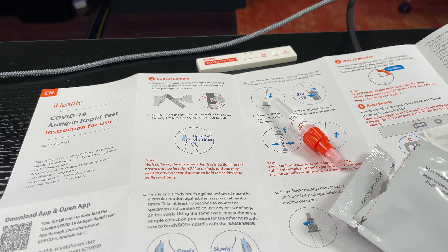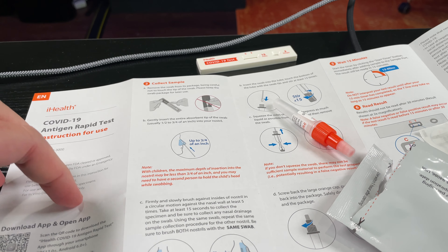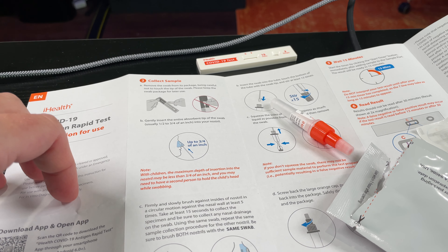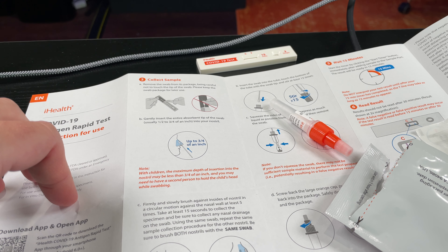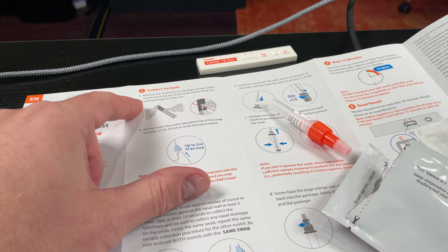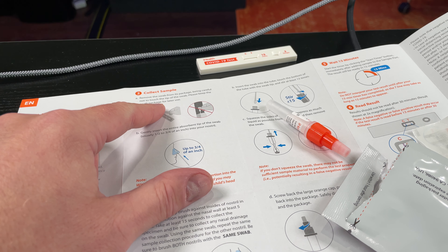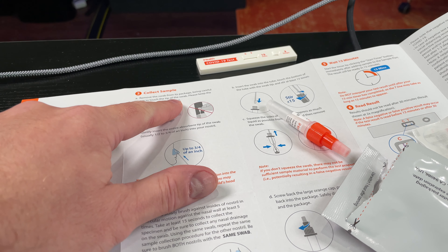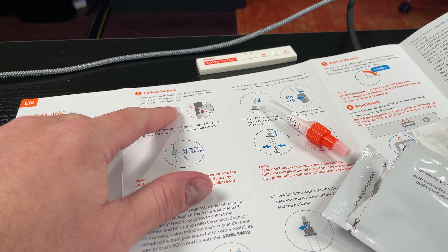Take out the test card. Collect sample — open the pouch, take out the COVID-19 test card and pouch, the tube filled with the extraction buffer and swab. When you're ready, proceed with the test. Open the full pouch of the test card. Step two is collect sample — it says remove swab from its package, being careful not to touch the tip of the swab.